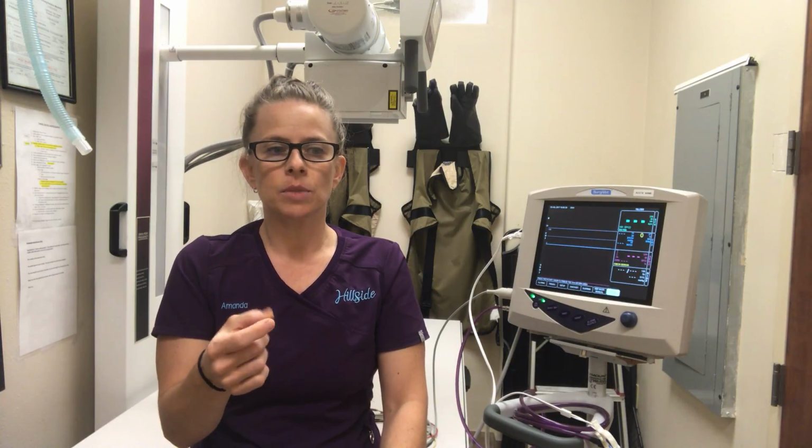Another one to test depth is the pedal response. So what you can do is take your fingers or an instrument, and you can pinch between the toes or a pad with a pretty good pinch, and if that animal withdraws their limb, then you know that they are feeling that stimulus, and they are not at a surgical level of anesthesia yet.